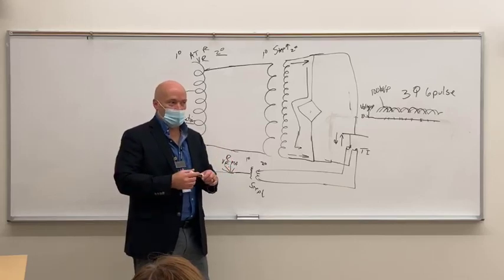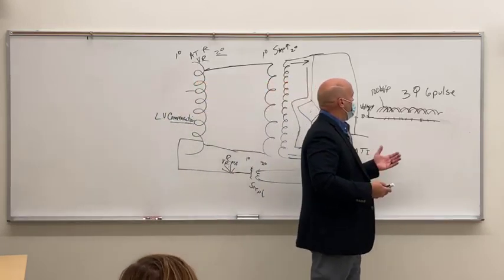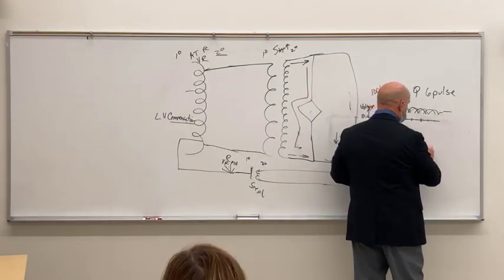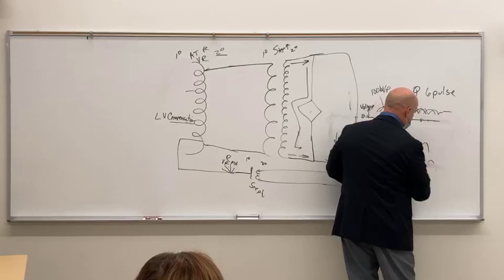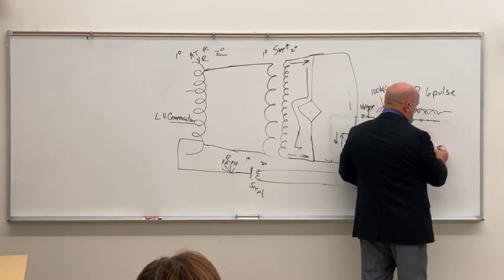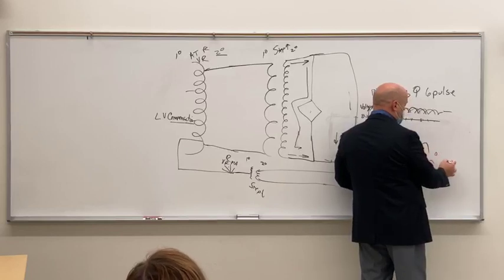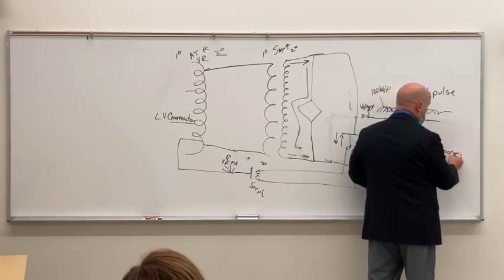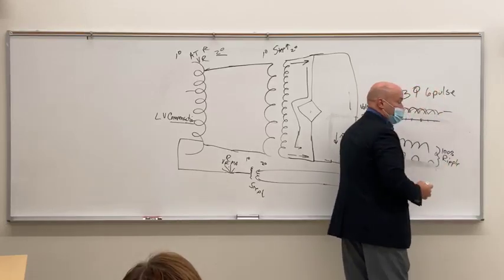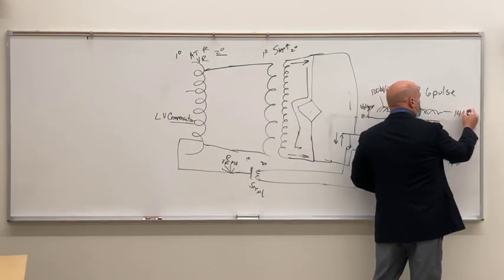You good with that? Okay, so somebody came along and said, well, that's great and all, but when we had single phase, regardless of whether it looked like that or that, our voltage, our power dropped to 0. Not only did it drop to 0, but the distance between the peak and the minimum energy, the swing there, was 100% in both of those. And they called that voltage ripple. All right, so 3-phase 6-pulse, that voltage ripple is about 14%.